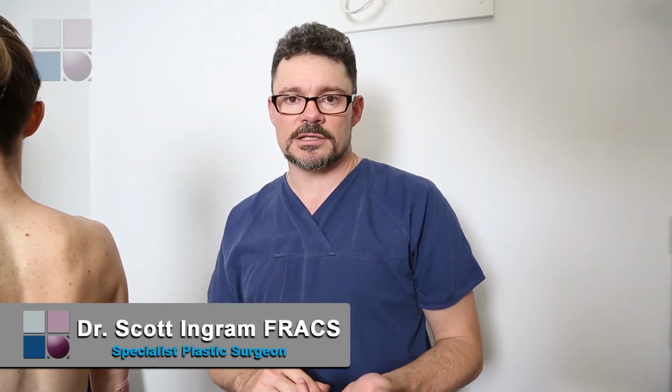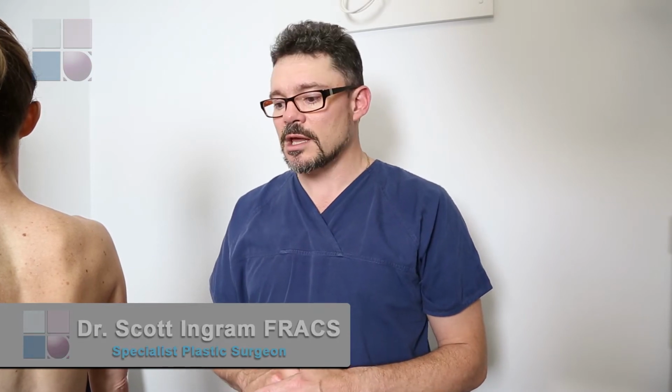Here in the clinic we also use 3D digital imaging to assess patients for breast augmentation procedures. We have a Vectra which allows us to capture some data that we can manipulate and use in assessing a patient, and also assist us in choosing an appropriate implant for the patient. It's a very good way of getting a realistic idea of post-operative outcomes.